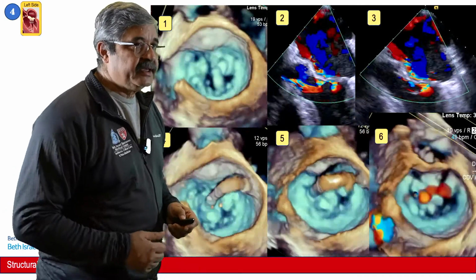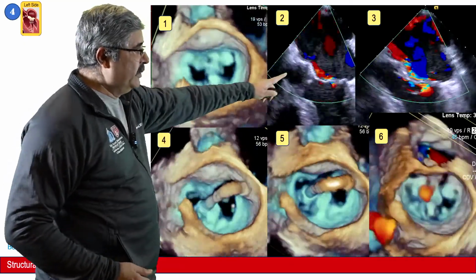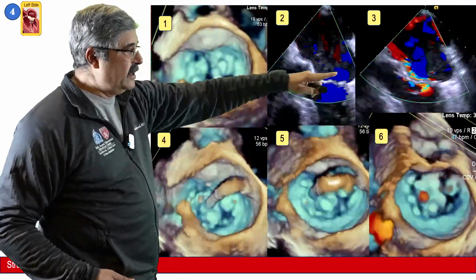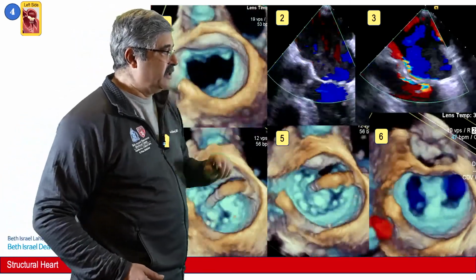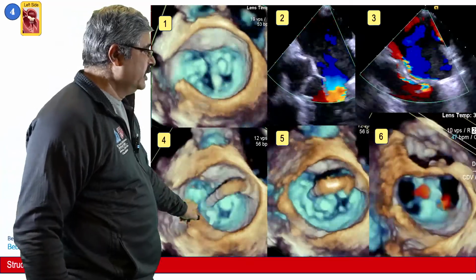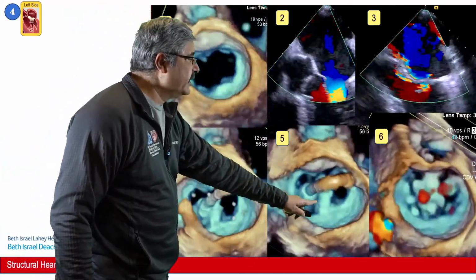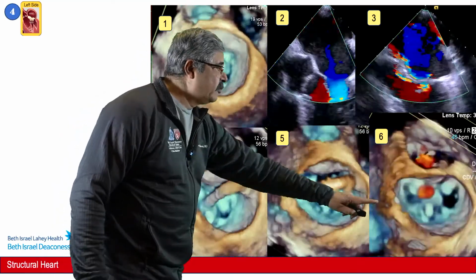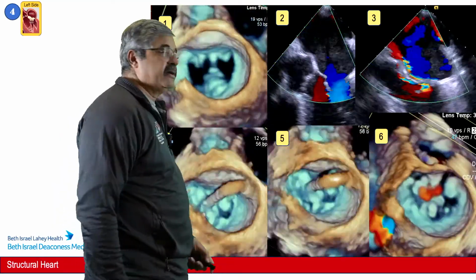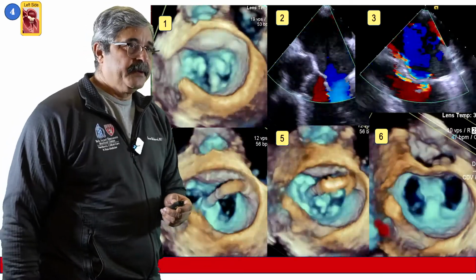For example, in this case, you can see that the patient has a flail P2. We apply a clip, optimize the clip, but there's still significant mitral regurgitation. So therefore, we ended up putting a second clip into this patient, which was a little lateral to the original clip. As you can see, this is the first clip right here. This is the second clip. And then once both clips are applied, the mitral regurgitation was significantly reduced to only trace severity.